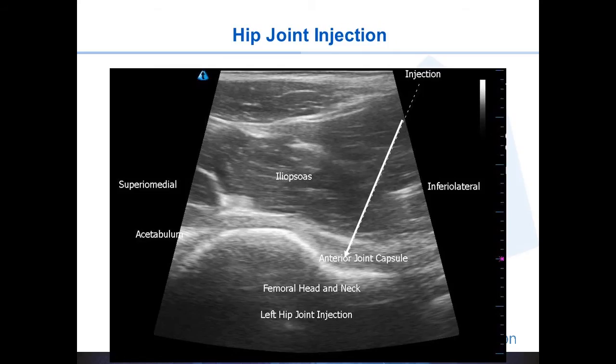This is the ideal image for hip joint injections. We see the iliopsoas running across the screen, the hyperechoic acetabulum, the hyperechoic femoral head leading to the femoral neck, and just above that the hyperechoic line representing the joint capsule. The injection should come at a very deep, steep trajectory. Warn the patient that as soon as you reach the joint capsule there may be a sharp pinch of pain, and make sure you go through the joint capsule rather than just displacing it. I try to get close to the bone and then inject, to confirm I am in the joint capsule.